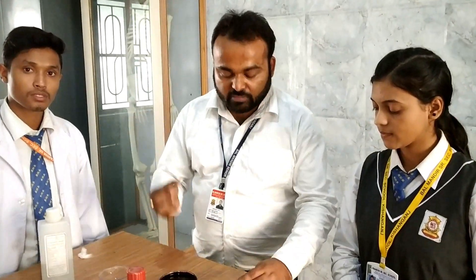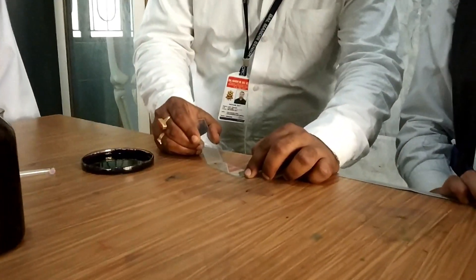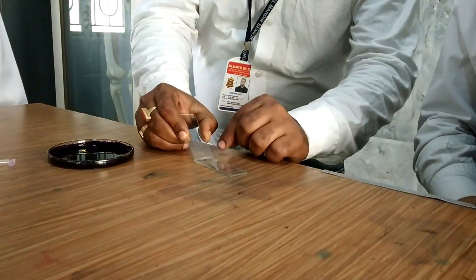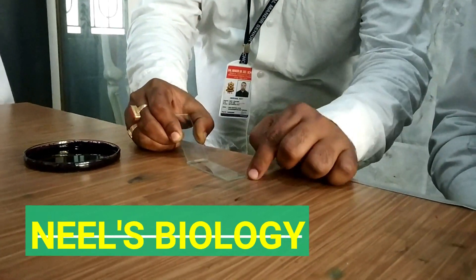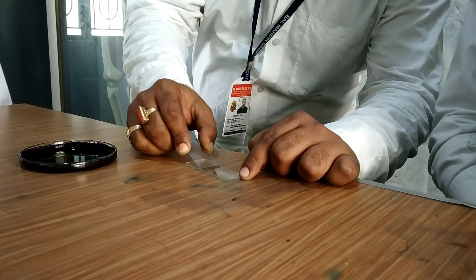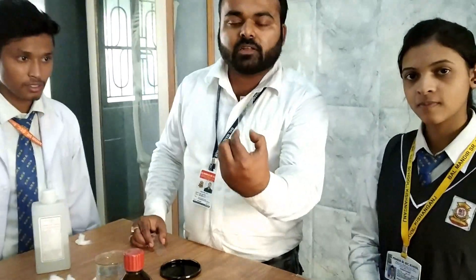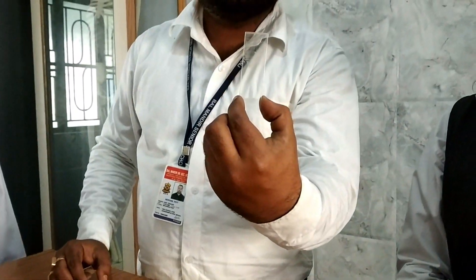After that we need to take another slide and hold it at a 45-degree angle. When you can see the blood has spread throughout the slide, we need to make a smear. This is the blood smear, which is very important in the differential count of human blood.